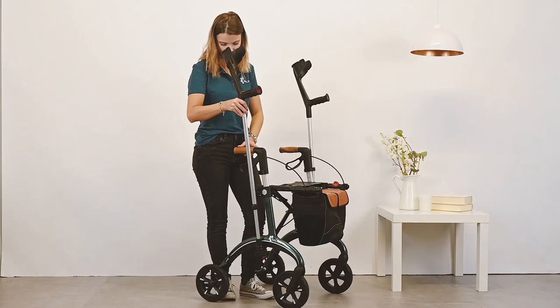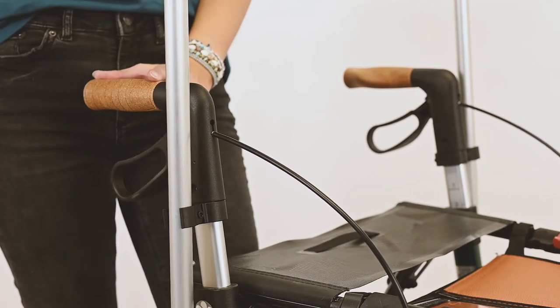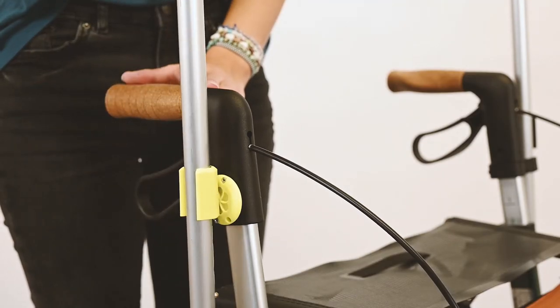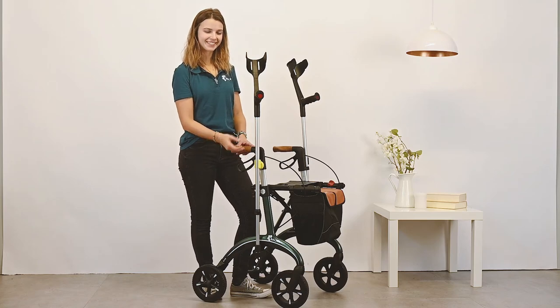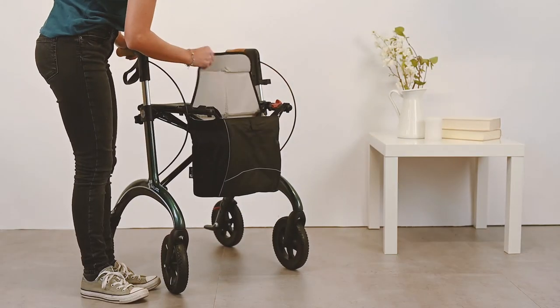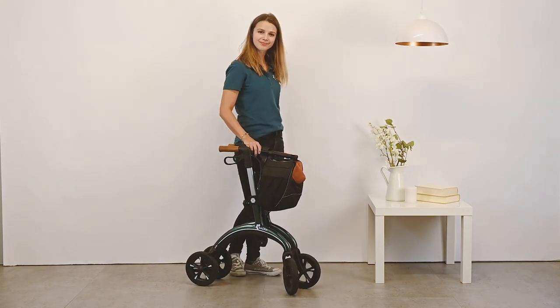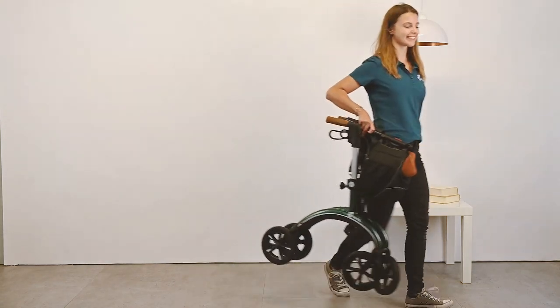The tray makes it easy to transport things from A to B. If you use crutches, no problem — just attach a second crutch holder to your walker. The crutch holder is also available in a magnetic version. The stylish flag is also available in black. You can find more information on www.salyol.de.